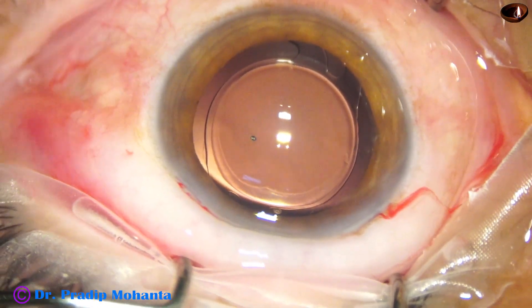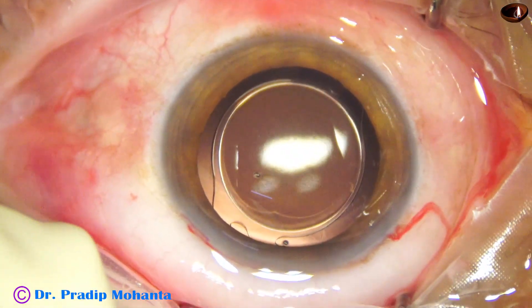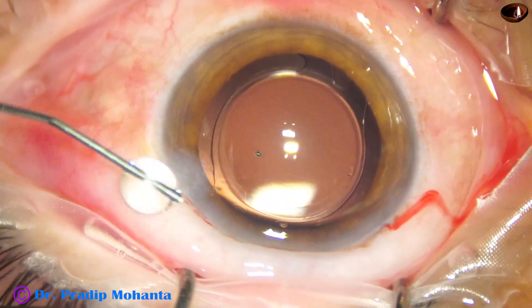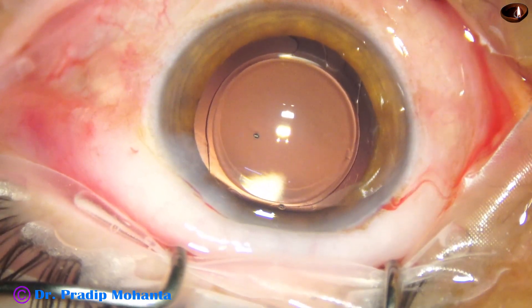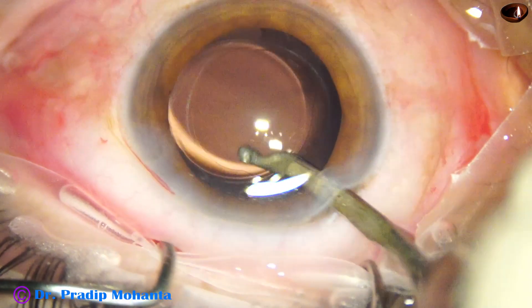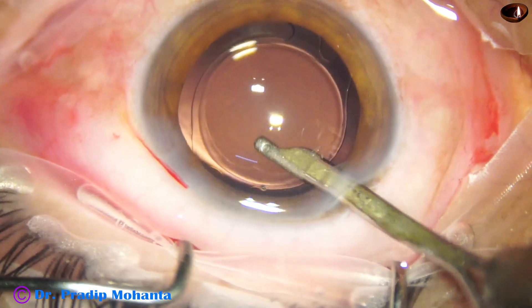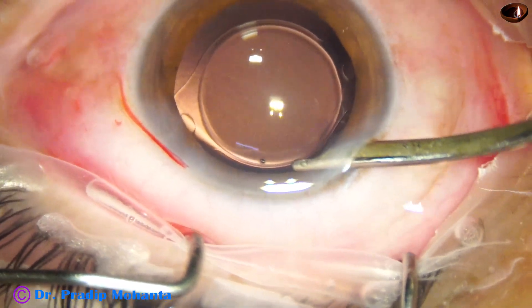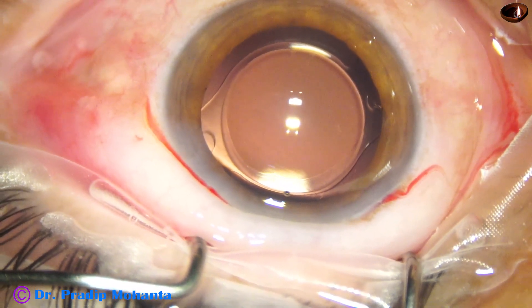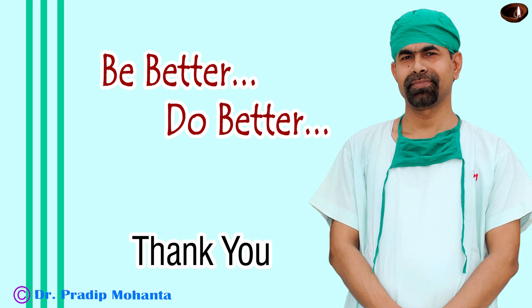You can see the intraocular lens is overlapped by the anterior capsular rim all around. This ensures good centration of the intraocular lens and there will be no tilt. The side port is closed by hydrating corneal stroma, and now a final lavage of the anterior chamber is done using a 23G Simcoe cannula. The anterior chamber is nicely formed after irrigating and aspirating. After a nice formation of the anterior chamber, integrity of the wounds are checked, and few drops of moxifloxacin are applied over the ocular surface. The case is concluded.